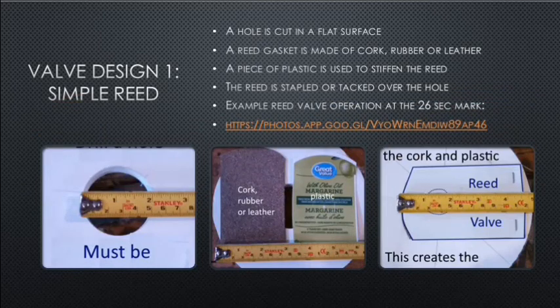Valve design one is a simple reed valve. Start with a flat surface, cut a hole in it, then use cork, rubber, or leather to make a gasket. On top of the gasket, put a sheet of plastic to stiffen it up, then staple on one side the cork and the plastic over the hole. In sample valves I've made, I've glued a nut on top to add a little more weight.